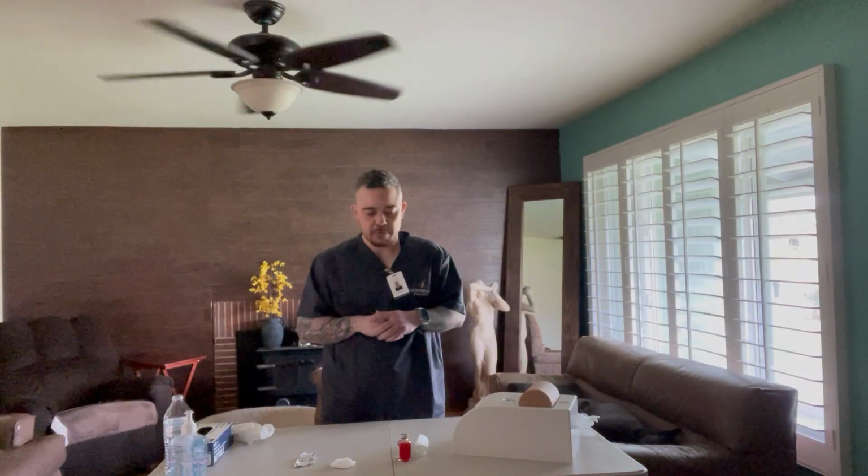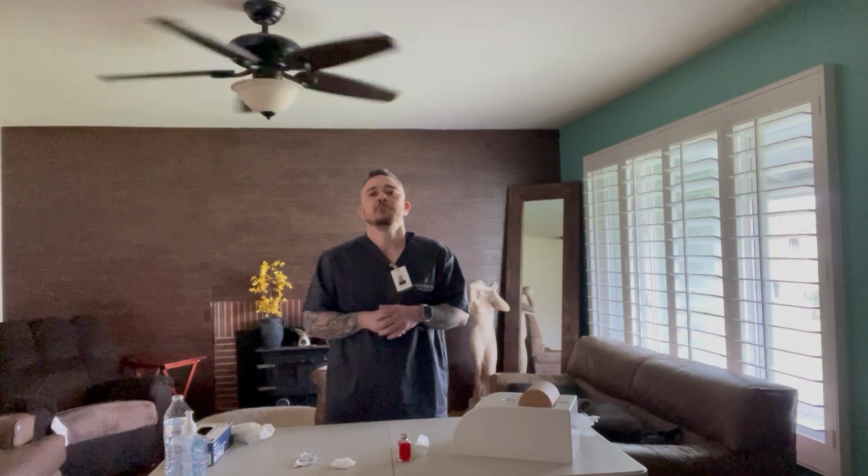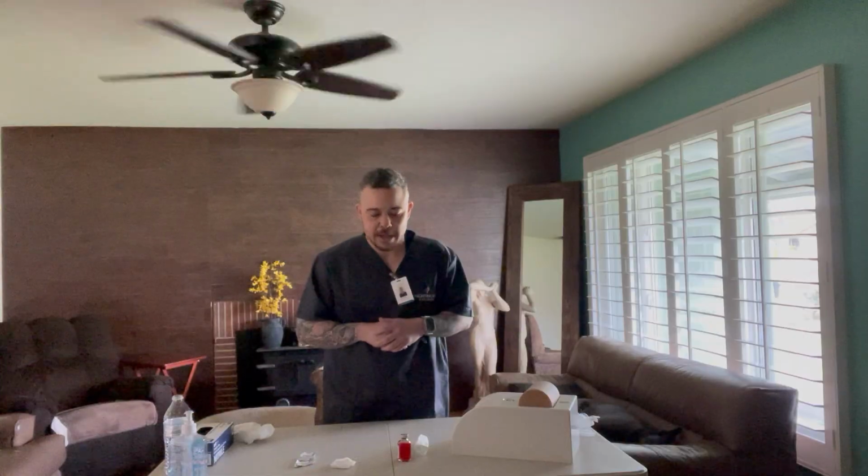Once that's done, I'm going to compare in the EHR on the MAR the provider's orders against the medication that we have here. The provider's order says to administer 1,000 units of heparin 1 time a day starting now. And our vial says we have heparin, which is 10,000 units, in a 10 milliliter vial. We're going to calculate that out, which comes to 1 milliliter, which is 1,000 units of heparin.